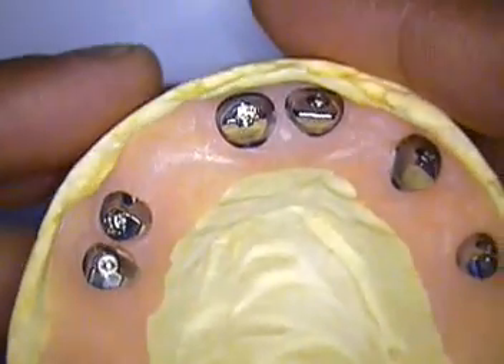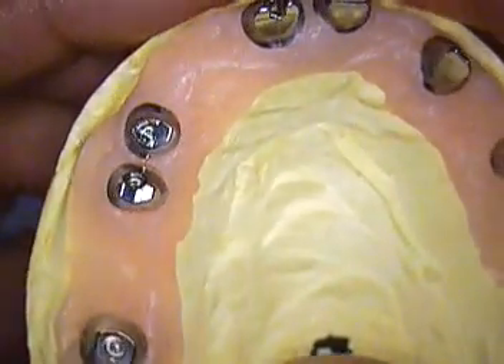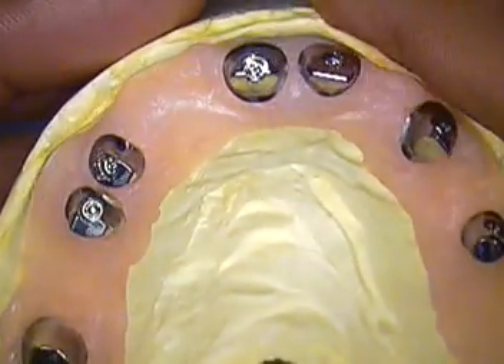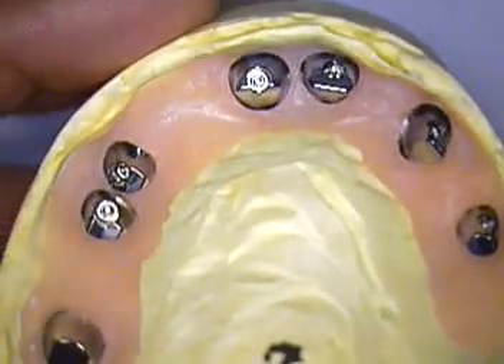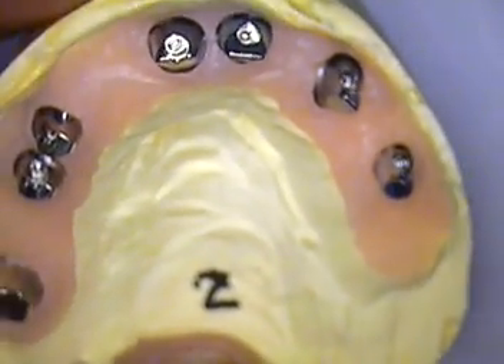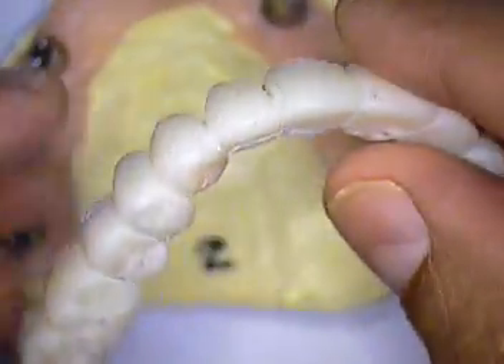Hello everyone and welcome back to Ken's Case. This is Dr. Jerry Cuomo here in Boca Raton, Florida. I have both sets of Atlantis abutments that were ordered via the internet. We did receive them back. My laboratory has taken the second set. But even before showing you our framework, I'm going to show you what we used prior to obtaining these abutments.